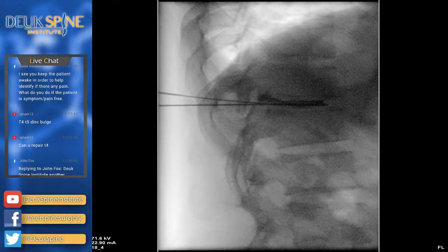You could see it was the top one. And it's much skinnier than the bottom, right, on the fluoro. The bottom is the needle. The top is the guide wire. Guide wires are always skinnier than needles. So our blood pressure is good. I worry about that because you want to make sure that you're not going to have high blood pressure and get a hematoma. Anybody ever hear of a hematomato? I knew I could get you to laugh at something.